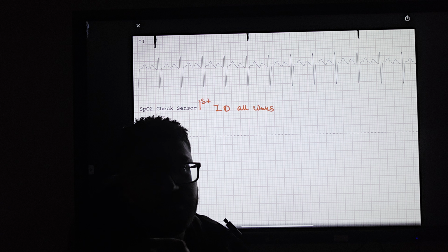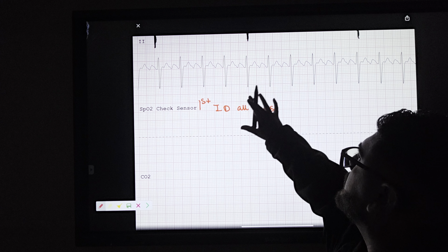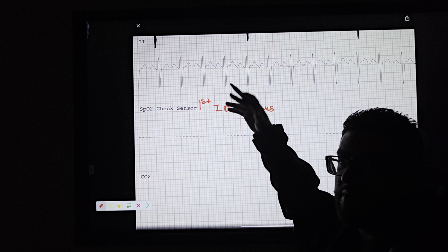Alright, guys, so let's go ahead and go over this atrial rhythm today. First things first, you're going to be looking at your strip, right? If you have a continuous monitor and you still have any issues, print out your ECG strip and let's take a look. I'm working on the board, so I might move some things around. I want you to zoom in on your screen if you can, please, and we'll go from there.